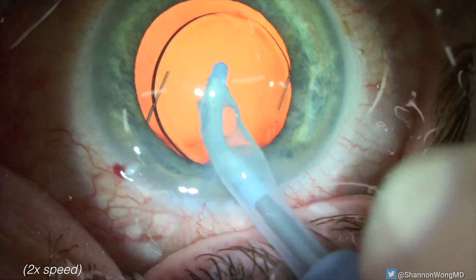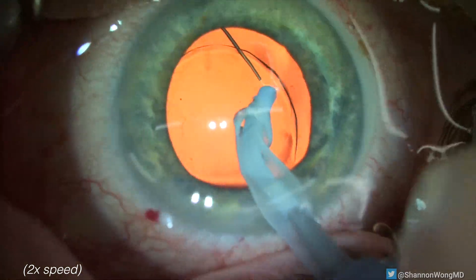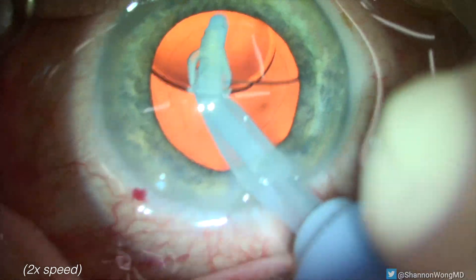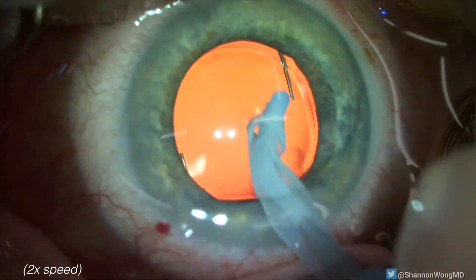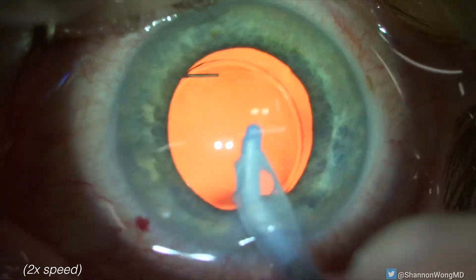We use the same tip to remove the viscoelastic after we implant this LI61AO monofocal lens. We just make sure that we do not place the exposed crack of the silicone tip IA in apposition with the posterior capsule.